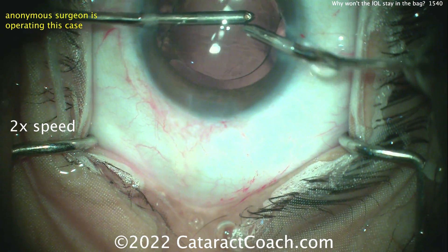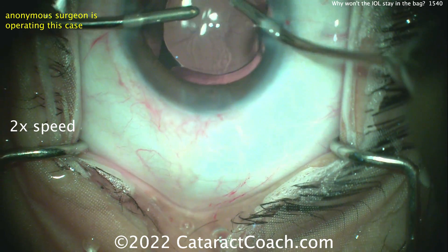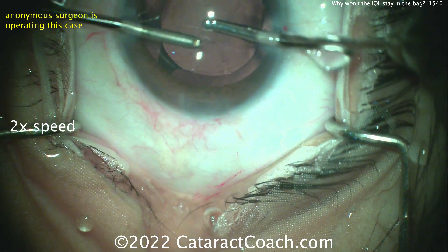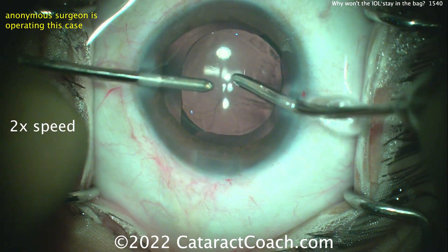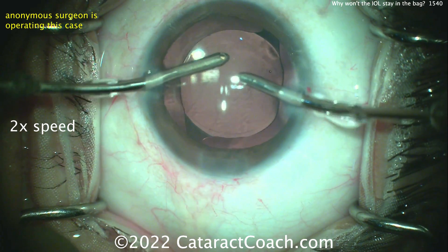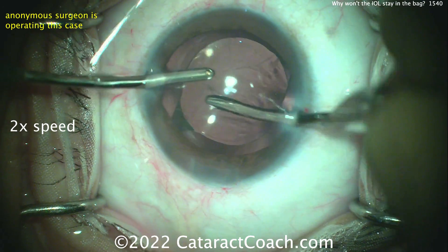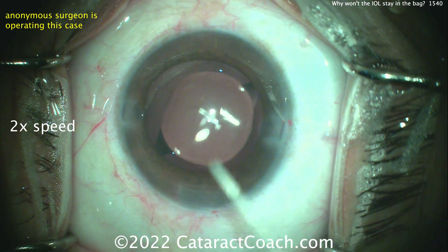We don't have any other history. You don't know if this patient had a history of, let's say, having a small eye, a lot of hyperopia, or a tight orbit. But look at the lid speculum — it's really cranked open here. If this is a small eye, say it has a 28-diopter lens, and the corneal white-to-white is a little on the small side, then maybe it's also a smaller orbit, and maybe you shouldn't have cranked the speculum so much. The lens wants to come up.